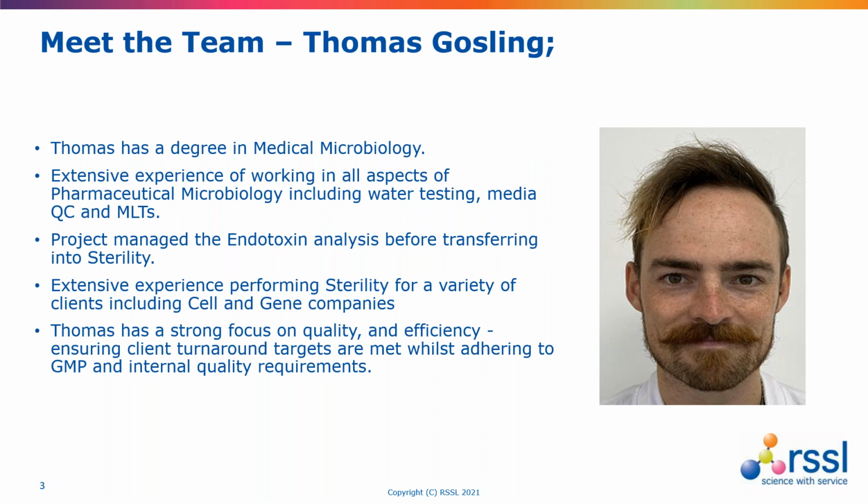Sure. So there are a number of problems that can appear when doing sterility testing and validations. They can appear when a product has antimicrobial or antifungal properties. This will affect the growth of the specific organisms that you need to add during validation. We can overcome this by using specific kit types, increasing or altering the rinse fluid amounts, and this is usually enough to overcome the problems. However, sometimes we may have to use specific rinse mediums, chemicals, or enzymes to inactivate the sample components.